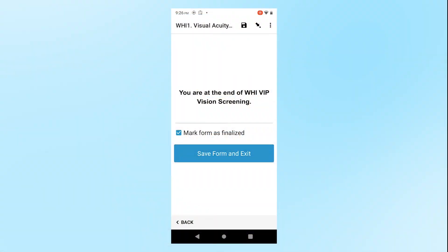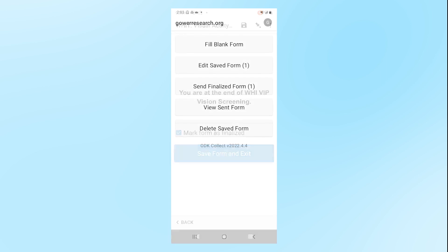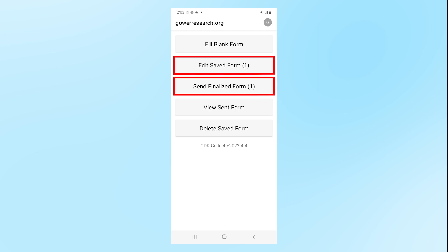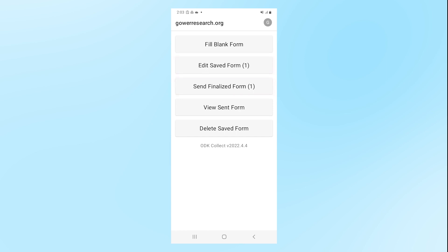On the last page of the ODK app, press Save Form and Exit. You will now see the number of completed forms in parentheses under Edit Save Form and Send Finalized Form. When you connect your phone to Wi-Fi, the finalized forms will send automatically. This is described in more detail in the phone training video and ODK manual. You have completed the vision screening portion of the Long Life Study visit.